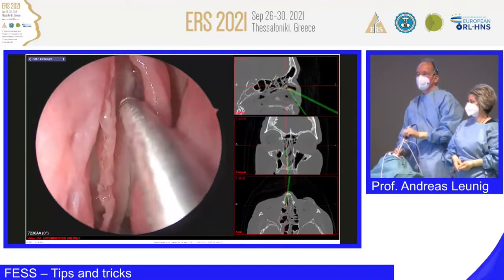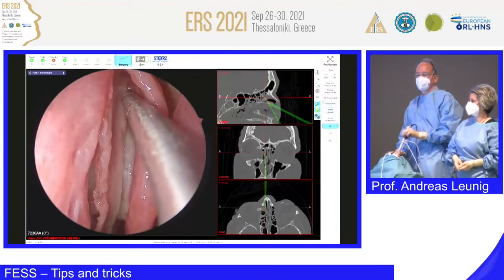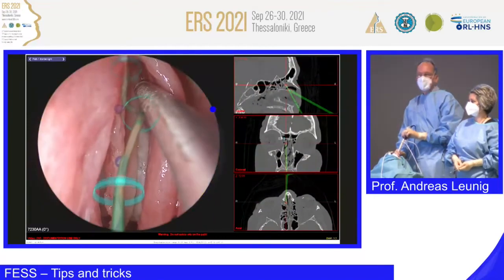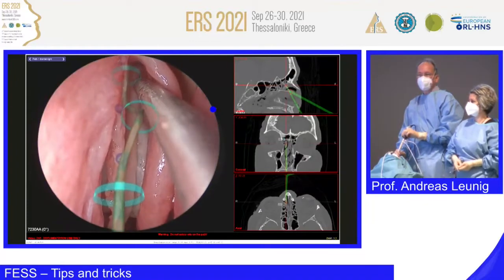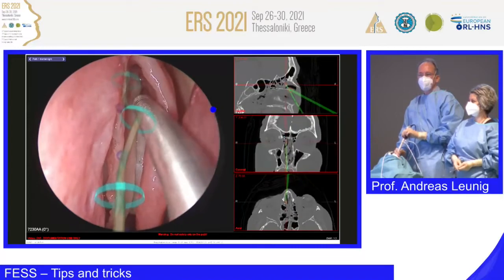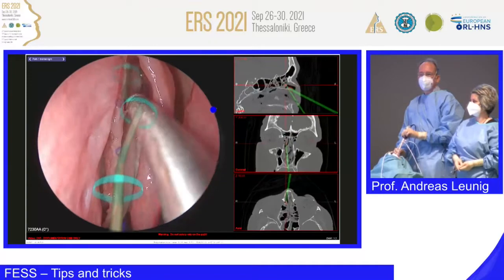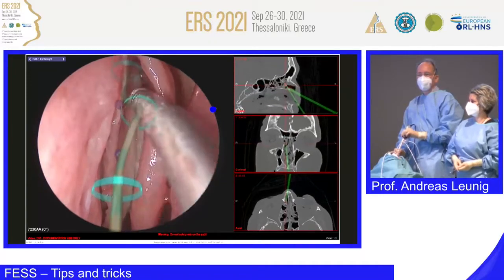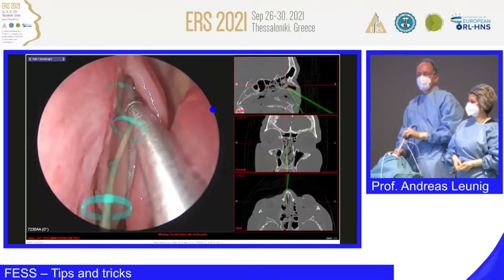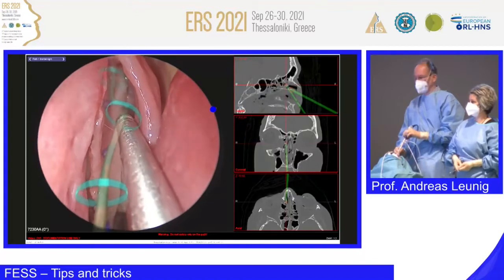And now we want to show the pathway. It's number one, please bring it in. And this is a pathway which we were using and putting into the CT scan to get some help. I mean, I have done this curve, I don't know why, but when the points are not in one direction, maybe there's some little curve, but we will see how much this will support our surgery, but I'm sure it will. So please hide it.